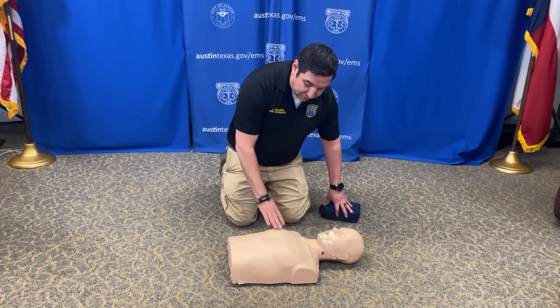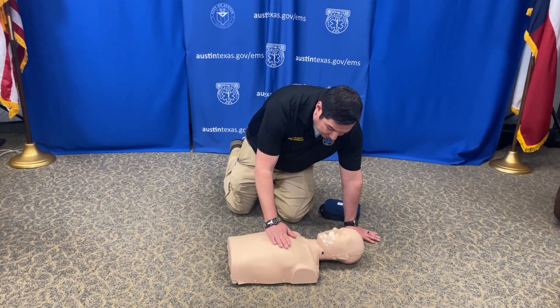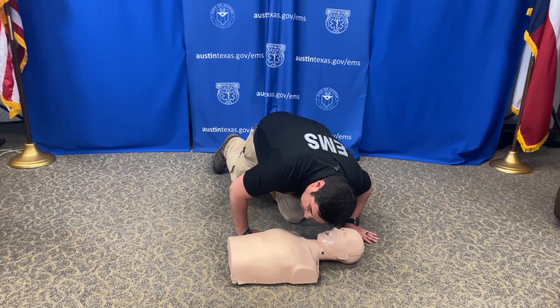If I don't get a response, then I want to check for breathing for about 10 seconds. You can either place your hands on the chest and check for breathing, or you can look, listen, and feel as well. Give yourself about 10 seconds.